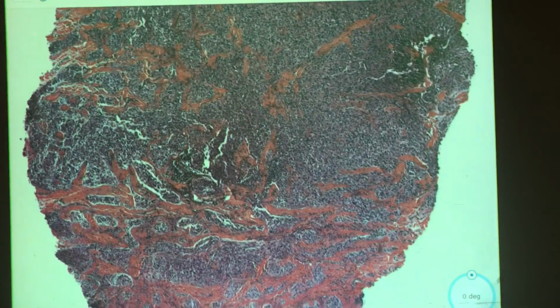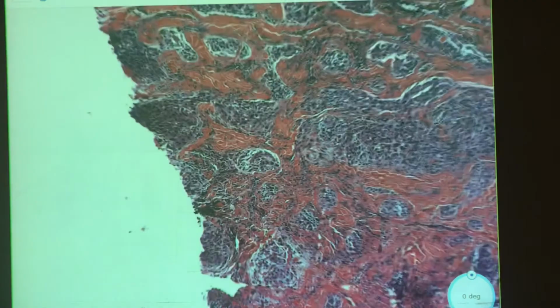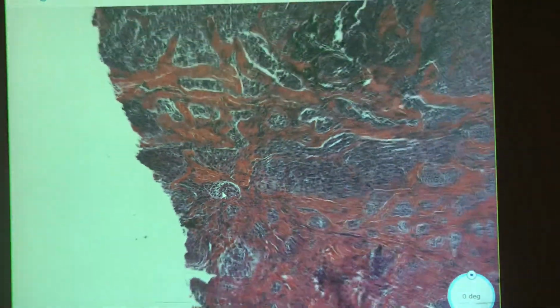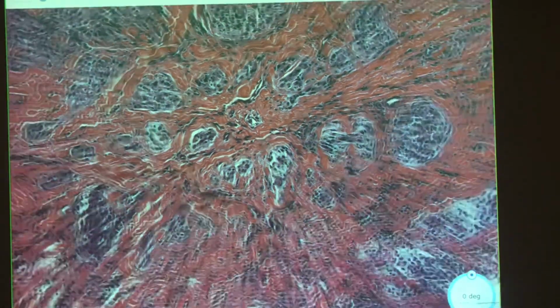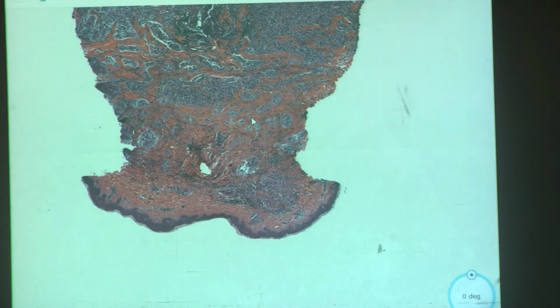Okay. Kind of like these? Yes, yeah. It doesn't have a very characteristic pattern, but to me they always appear a little more nodular, or with vague nodularity. And a lot of the other features that you can see with this lesion, I don't think are necessarily here. I may change my mind spending a little more time on it. It happens. I can admit that.